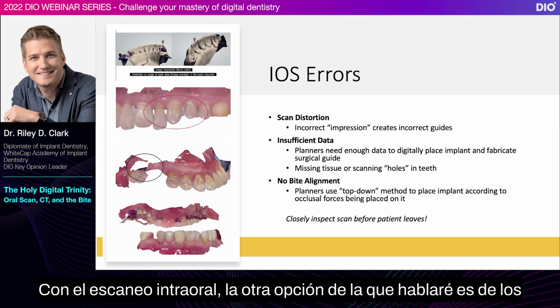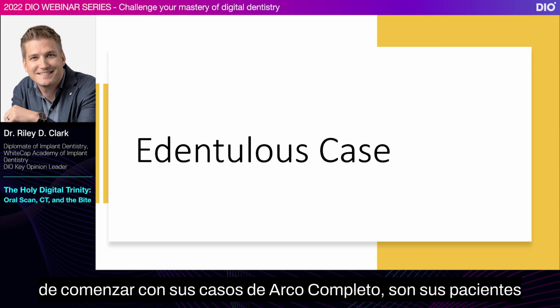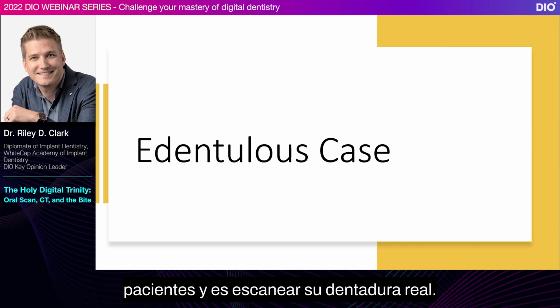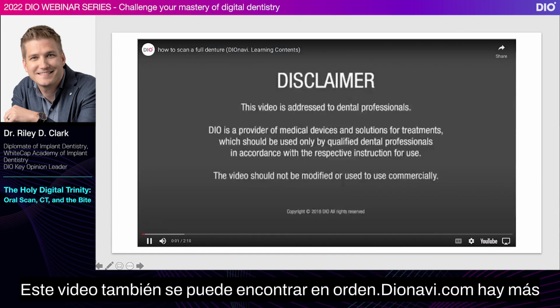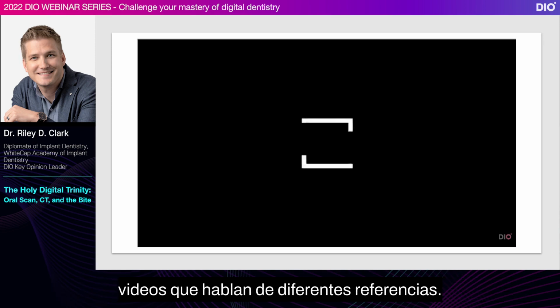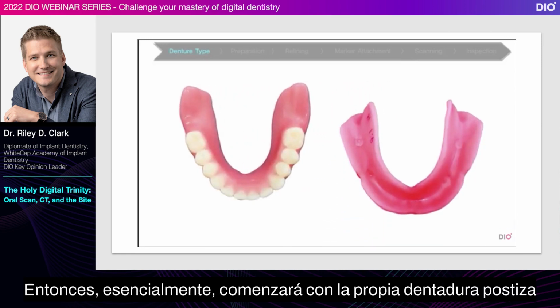The one other option I will talk about is the edentulous patient. Patients that are already edentulous, which I think is a great way to start with your full arch cases, is your current denture patients. We're going to use a special scan for these patients, and that is scanning their actual denture. I'd like to play this video and I'll narrate through it. This video can also be found on order.dionavi.com. There are more videos there that talk about different references.